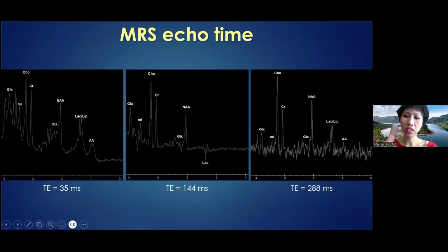The idea is that because of the J coupling of the methyl group on the lactate doublet, you could invert below the baseline if you had a lactate peak. But honestly, this is really obvious. If it's a big lactate doublet, it's not going to be a diagnostic dilemma. So why would you waste time doing another one unless you want it for a talk or something?